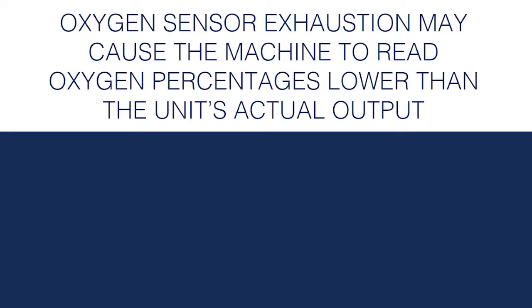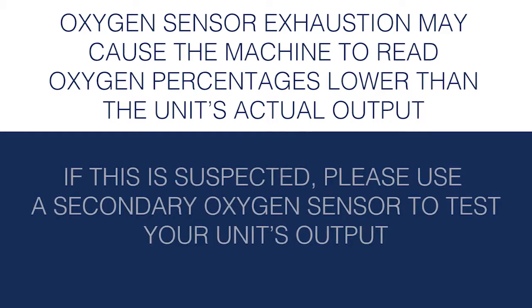Oxygen sensor exhaustion may cause the machine to read oxygen percentages lower than the unit's actual output. If this is suspected, please use a secondary oxygen sensor to test your unit's output.